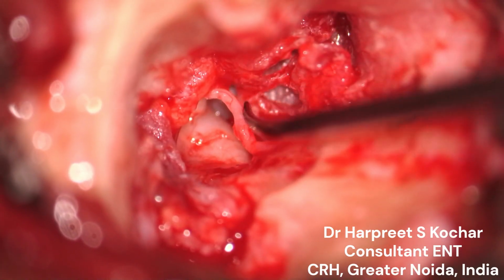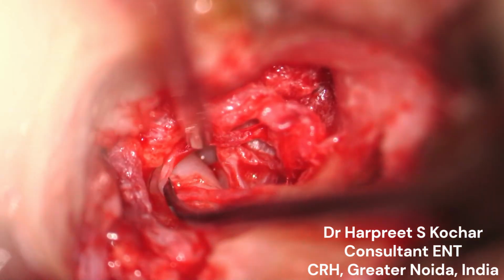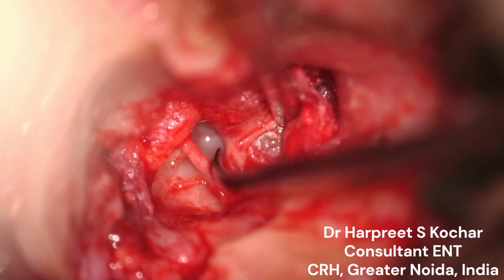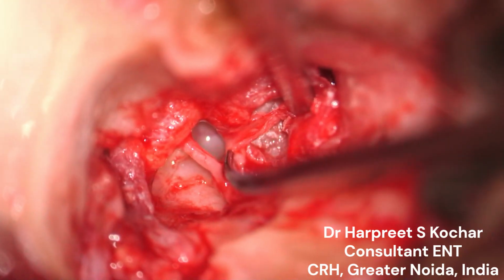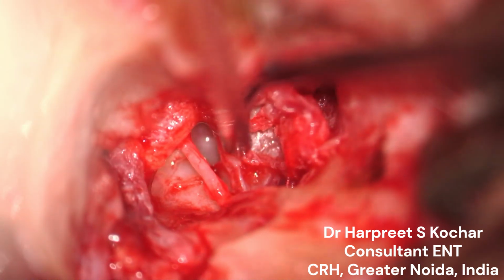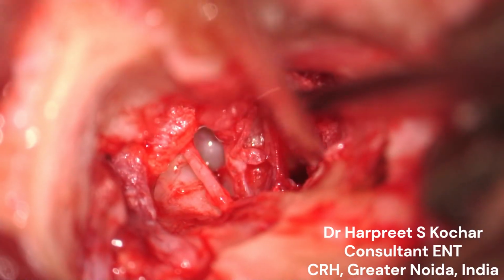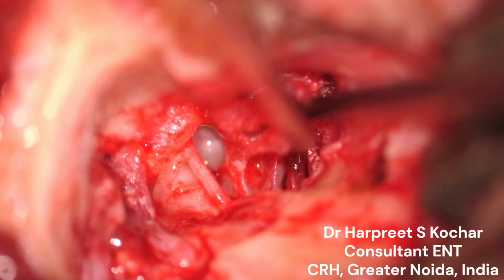Now the disease is taken off from the anterior part of corda tympani, and then we try to lift it off the stapes suprastructure as well as the promontory. The dissection of disease from the suprastructure is to be proceeded in posterior to anterior direction so that the stapedius tendon holds the suprastructure in place and any inadvertent dislocation of the stapes suprastructure is prevented.